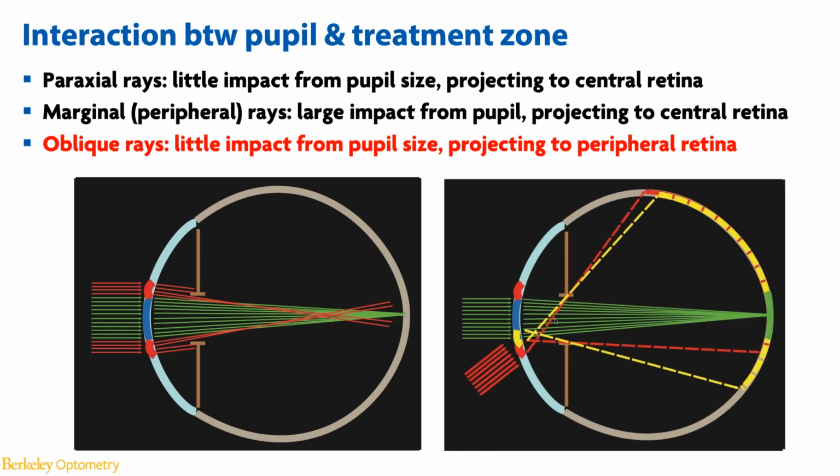And for those of us who really want to push for the treatment zone to be smaller and having that paracentral steepening to be inside of the pupillary region, you can see both the angle of projection or the extent of the peripheral defocus has changed a little bit, but not nearly as dramatic as what we expected. So it really goes back to our hypothesis of why Ortho-K is working in myopia control.